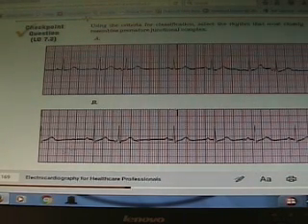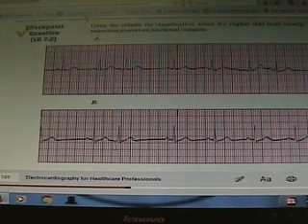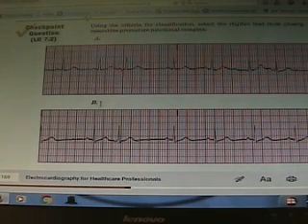But let's look at this one. P, Q, R, S, T, kinda. It's kinda missing. And the other ones look normal. Do you see how there's no bump? It's almost flat. It's not even 1 millimeter in deflection or 1 millimeter high. So B is the correct answer.